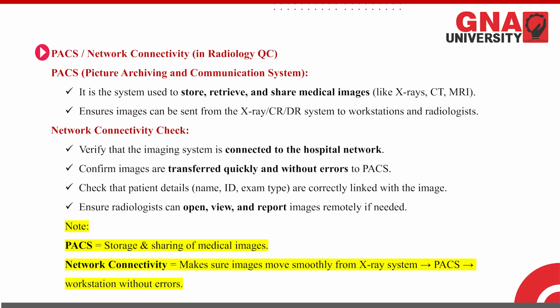So if our PACS system is working properly and our network connectivity is proper, then the radiologist can report our image remotely also. And simply, what is PACS? It is storage and sharing of medical images. In the PACS we can store our data and share the data with the help of this Picture Archiving and Communication System. And network connectivity makes sure images move smoothly from the X-ray system to PACS and from PACS to the workstation without any error. We have to check this also. These are the tests which we perform on a daily basis on the DR system.